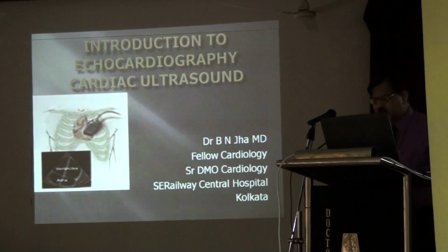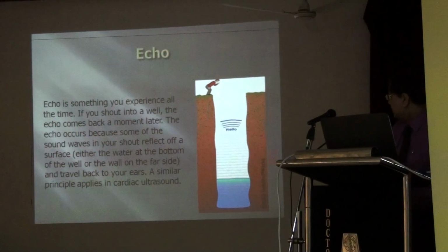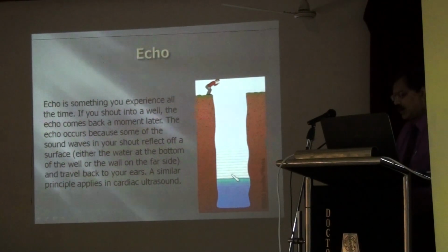So let me begin with the first: what is the echo? Basically, echo is something you experience all the time. Suppose you are shouting at a wall, you hear the same sound reflecting back from the wall. Similarly, this applies to the principle of ultrasound. What happened?